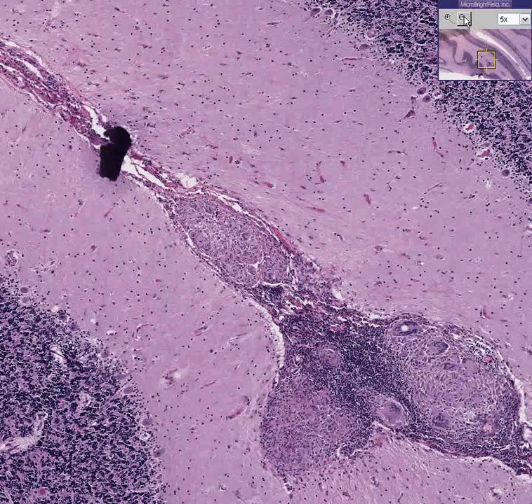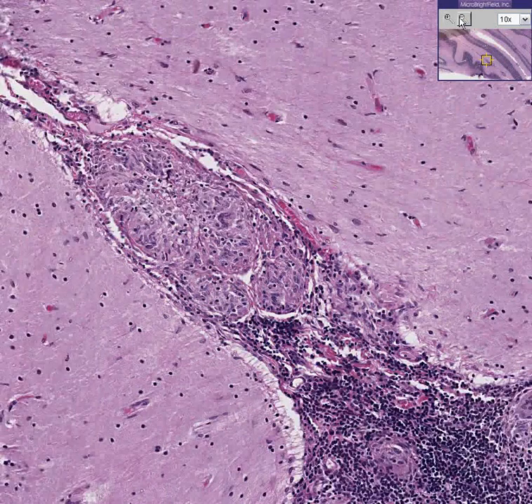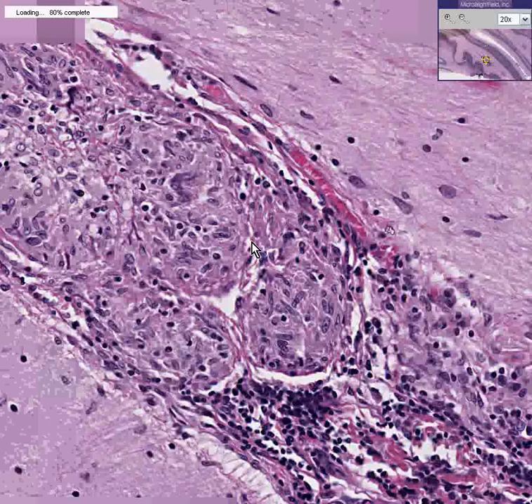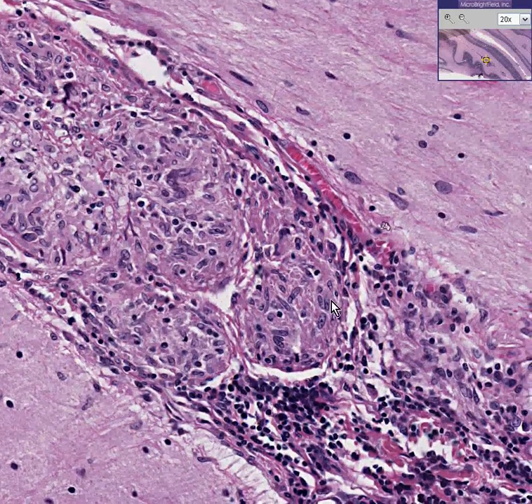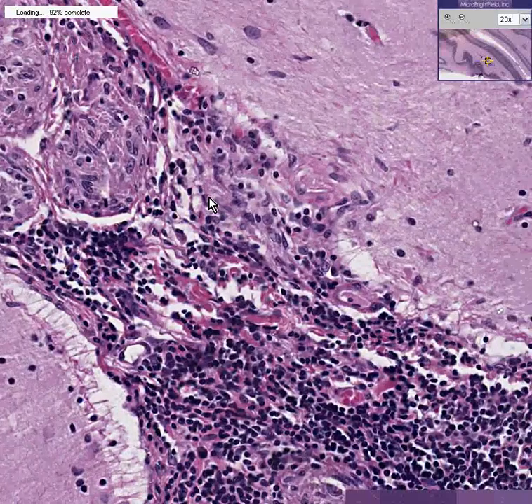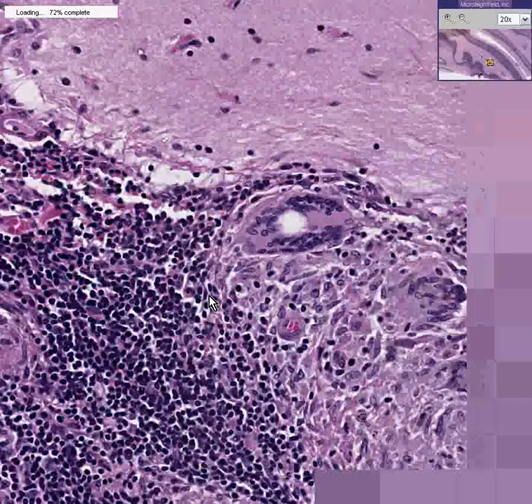And once again, it shows that granuloma of sarcoidosis could not only involve lung and soft tissues and upper respiratory tract, but it can also involve a brain and cerebellum, can't it? Of course it can, because that's exactly what we're seeing here in this case.